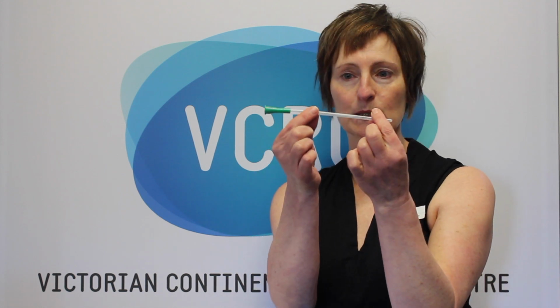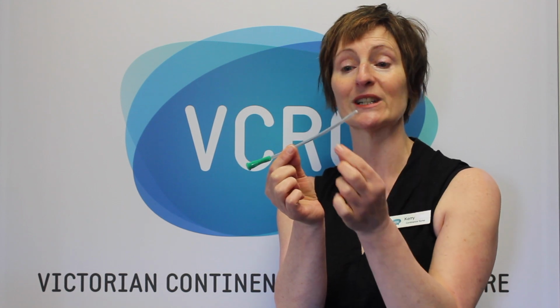And there's two basic types of catheters, and the first one I'm only going to talk about briefly, and it's an intermittent catheter, and that's what this looks like. So this is a female length. There are some people in the community who will insert this catheter through the urethra, or the tube draining the urine, into their bladder. They'll drain the urine out and then they'll remove the catheter and dispose of it, and then they do it again in a few hours time.